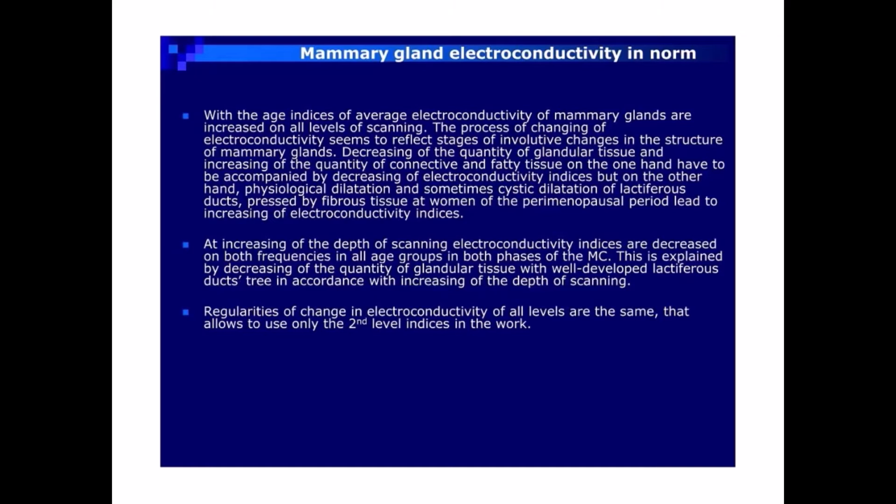At increasing of the depth of scanning, electroconductivity indices are decreased on both frequencies in all age groups in both phases of the MC.